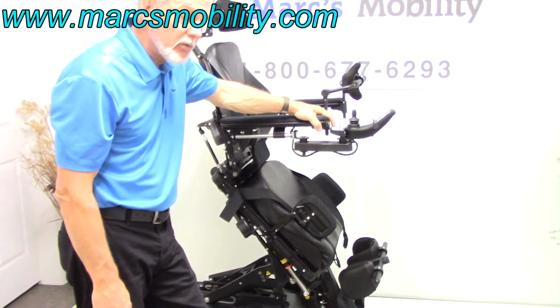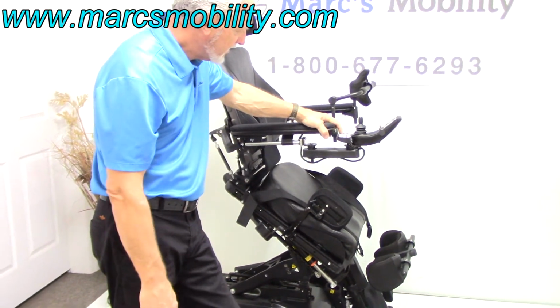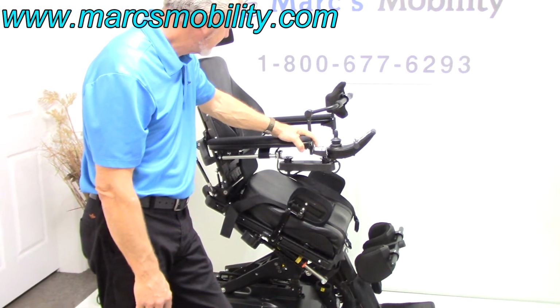Also, you should always consult with your physician before you use one of these, especially if you have not stood up in a long time. You definitely need to get a hold of your physician. Make sure it's okay for you to have one of these chairs.